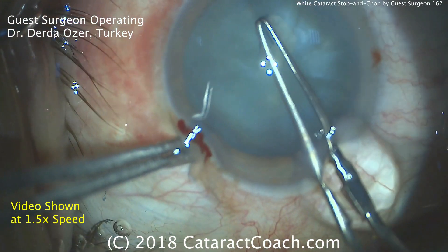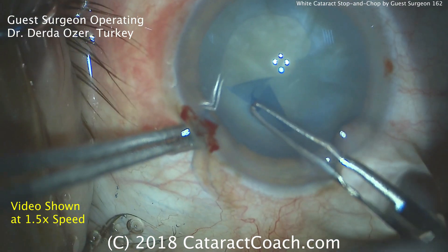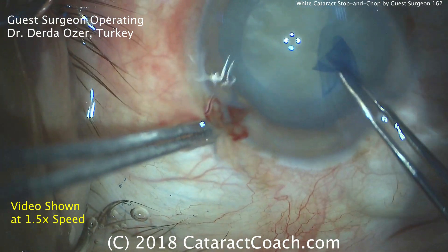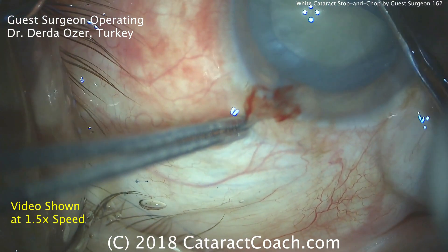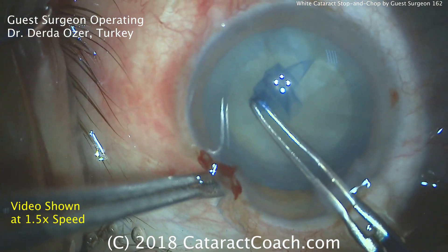while the right hand uses the capsulorrhexis forceps to create a capsulorrhexis. That looks good, coming around nicely, nice and round. I like how the surgeon is floating in the incision — good technique. The anterior chamber is not collapsing; that left hand holding the eye certainly helps. We have a nice round capsulorrhexis, beautifully centered.